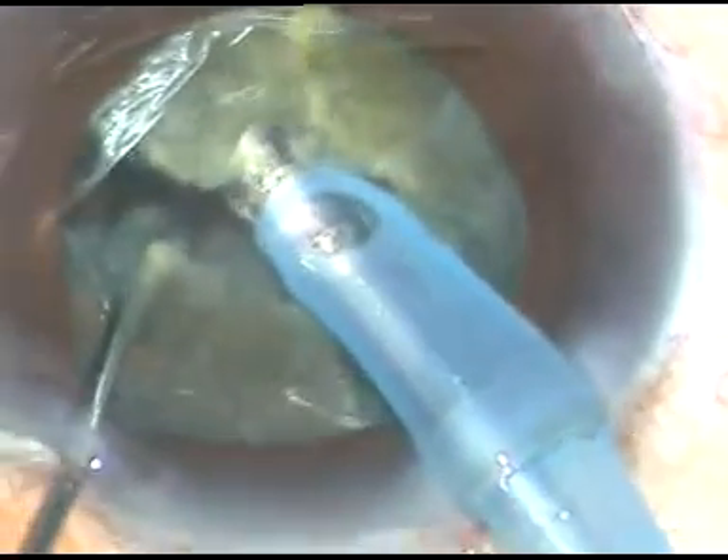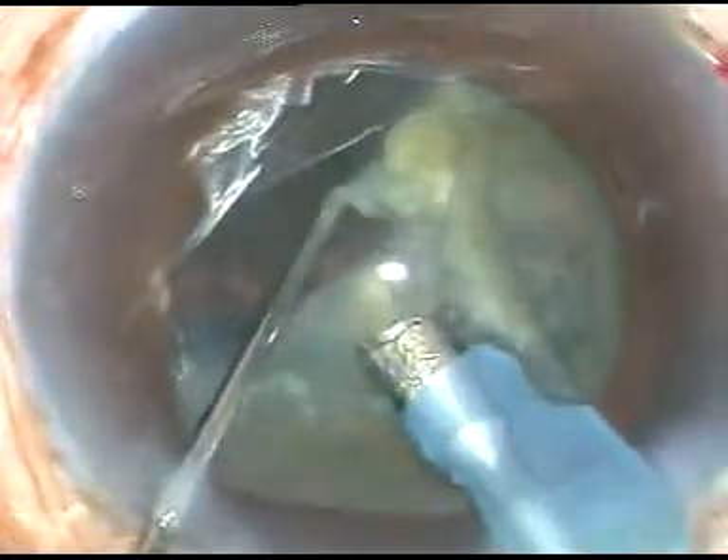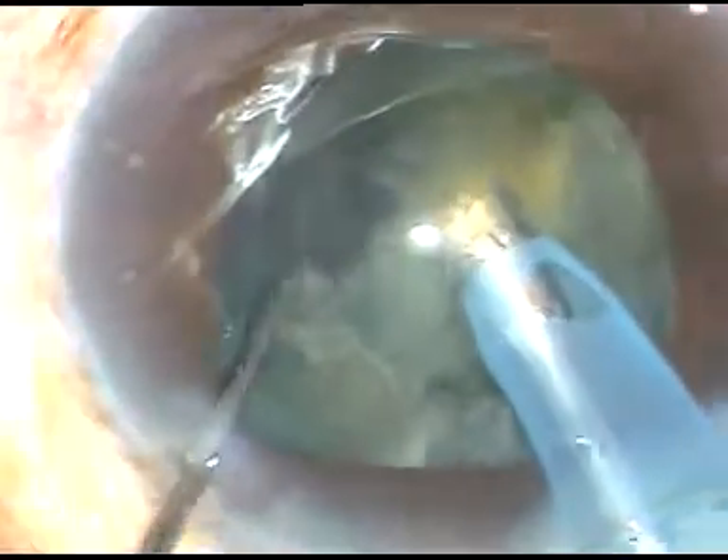This free nuclear fragment is removed. Now the phaco tip is turned towards 7 o'clock — this is called the 7 o'clock jab. This free nuclear fragment is also removed. By this time, enough hydro-dissection has occurred naturally, meaning the fluid has gone from center to periphery over the posterior capsule. So hydro-dissection has not been done deliberately, but it has occurred naturally.